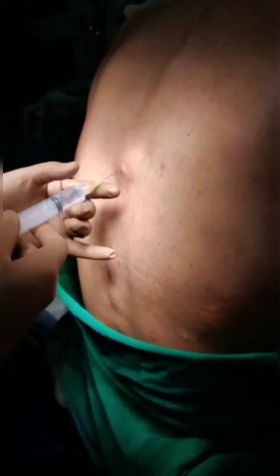Infiltrate about 4-5 ml of 2% lignocaine at the skin and subcutaneous tissue using a hypodermic needle to maximize patient comfort. This needle will also help us identify the right direction and depth to the epidural space. In the lumbar level, as the spinous processes are short, stout, and straight, you can introduce the Tuohy needle in the midline perpendicular to the skin. But in thoracic vertebrae, the spinous processes are angulated downwards, so here we have to introduce the Tuohy needle in the midline at an angle of 35 to 45 degrees cephalad.